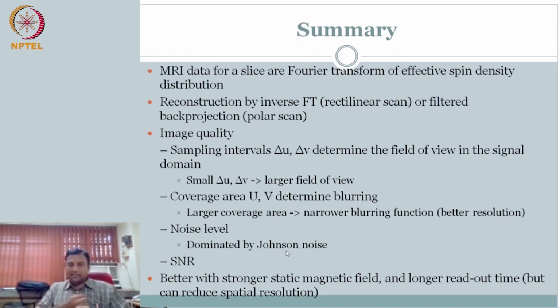In MRI, you have several different properties that come in. There it was mu in X-ray CT. Then we talked about only the acoustic scattering or impedance mismatch in ultrasound. Whereas here, look at the different fundamental properties of the tissue: spin density, the relaxation time in transverse, the relaxation time in longitudinal. This is what we covered. There are other parameters as well.